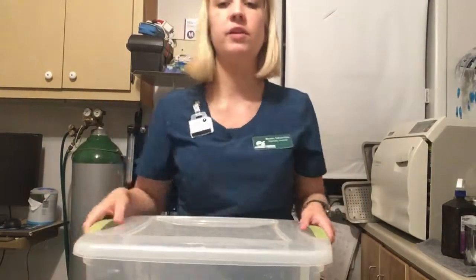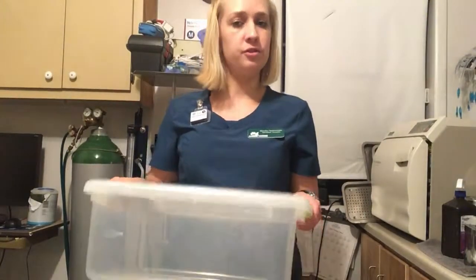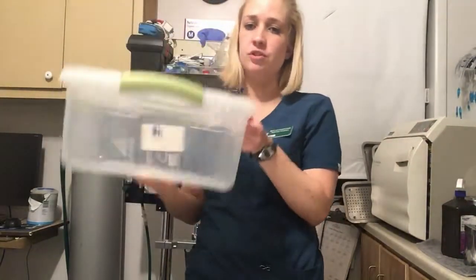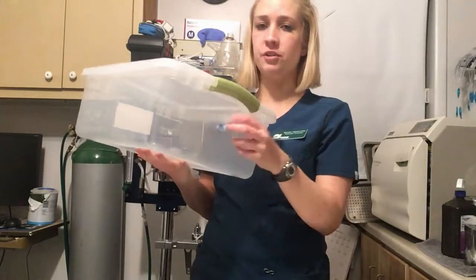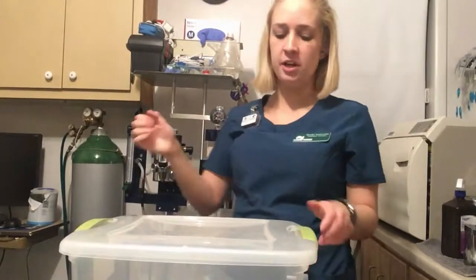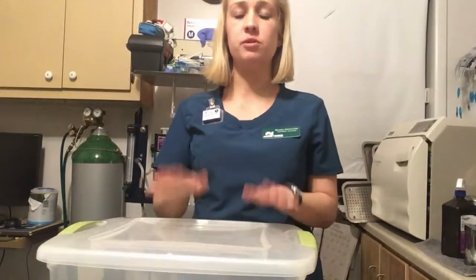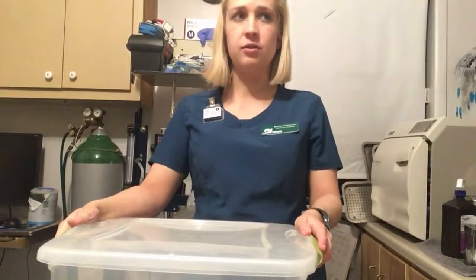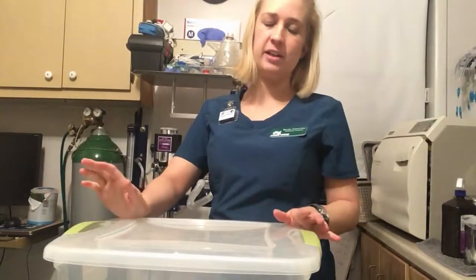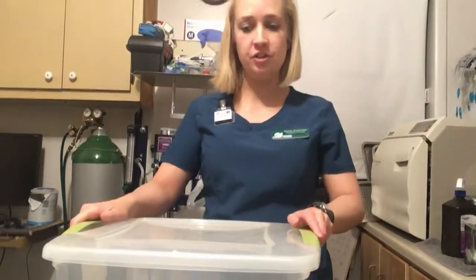The other thing to go over is induction chambers. We don't have an official one, but we do have a makeshift one. It's a chamber that can be securely closed, and it has a hole at the end that will be attached to the circuit, which is attached to the anesthesia machine. We use these for smaller patients, or cats or other animals that may have become fractious and won't sit still for an IV induction or even a mask induction.